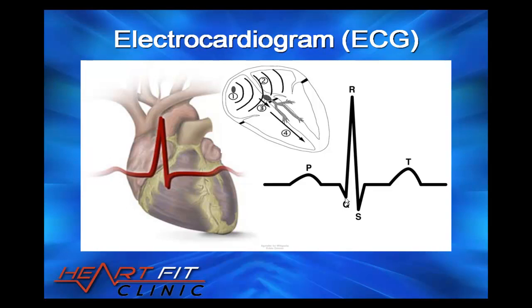And there are 3 ways in which an electrocardiogram is used. Just quickly, it can be an electrocardiogram on its own just by sitting and resting, a Holter monitor, or a stress or treadmill test. And we'll go over this in more detail when we talk about the diagnostic tests. So let's start off by showing one heartbeat and what happens during this one heartbeat.